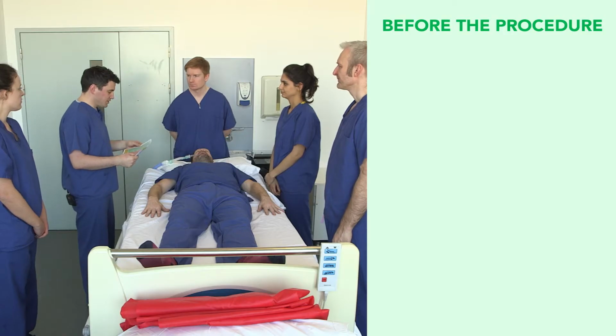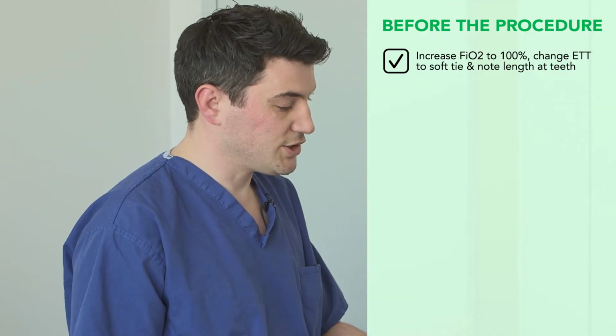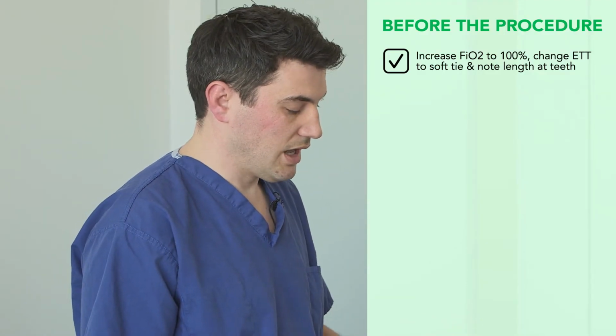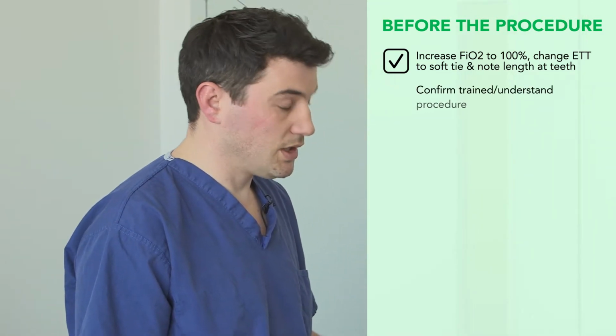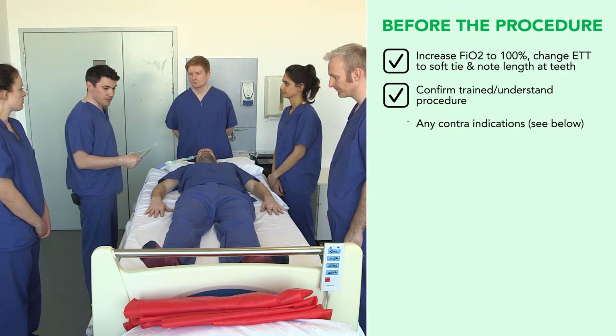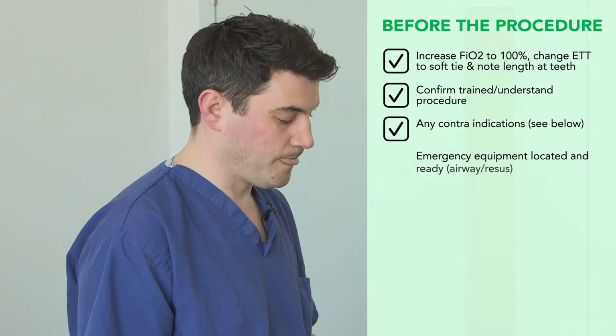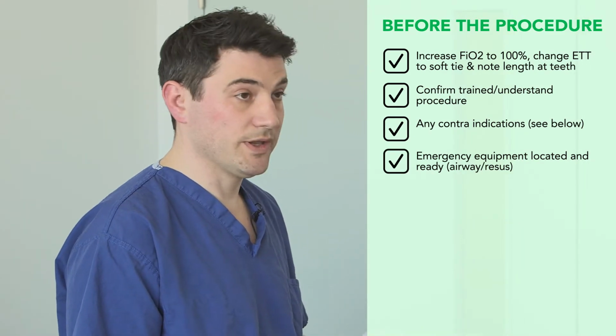So prior to starting the procedure, we're going to increase the oxygen to 100%. We'll ensure that the ET tube has soft ties, and that we'll note the length of the teeth, which in this instance is 25 centimetres. Everybody in the team is trained and understands the procedure, and we've established that the patient doesn't have any contraindications. We're all aware of where the emergency equipment is located, both airway and resus.